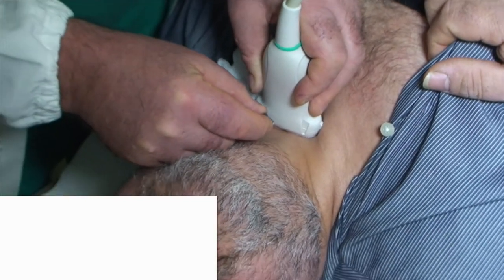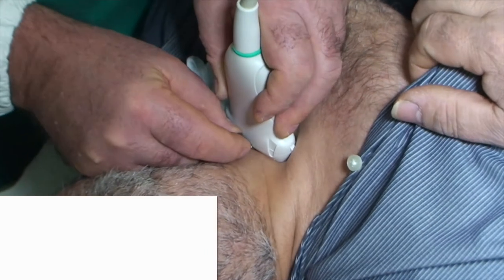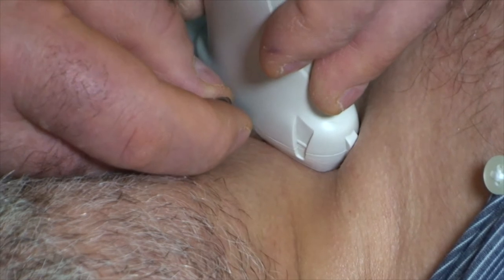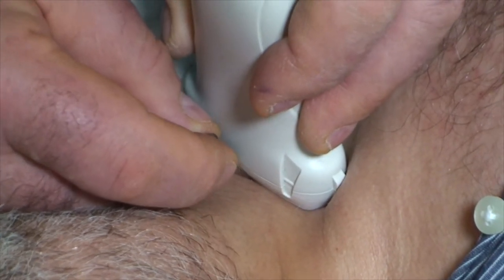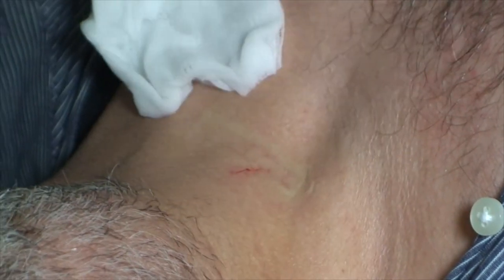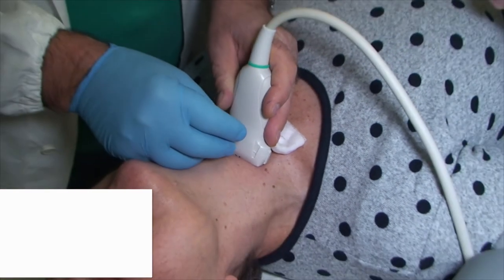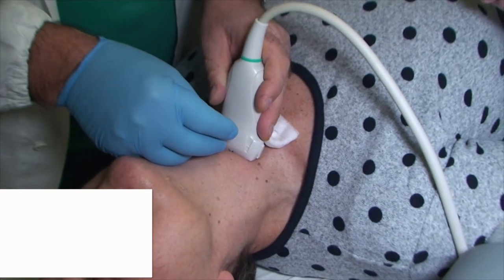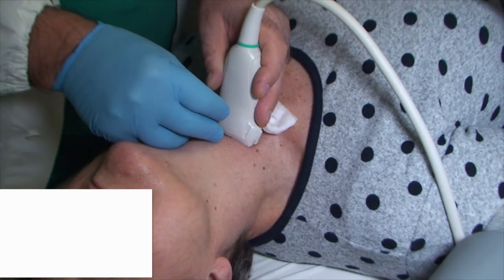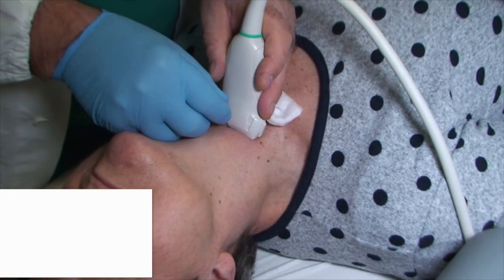Another way to proceed is through sampling by capillarity. In this case, neither a syringe holder nor aspiration is needed. A single operator places a needle between the thumb and forefinger of the dominant hand. With the other hand, he immobilizes the node to be targeted. The needle penetrates into the lesion as previously described, with the same back-and-forth movement. Some specimen enters the needle by capillarity. Finally, the needle is removed from the lesion.